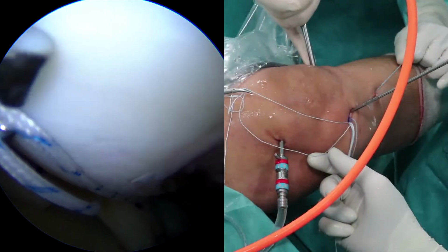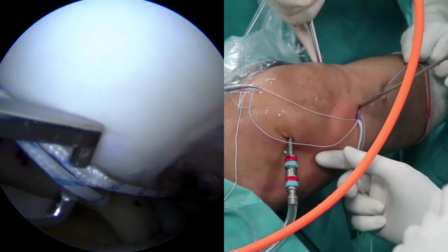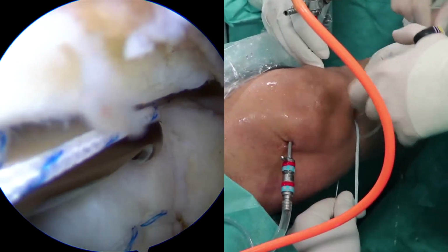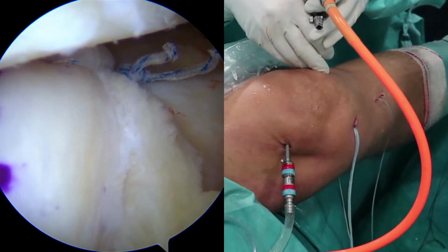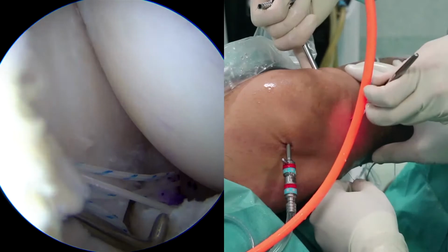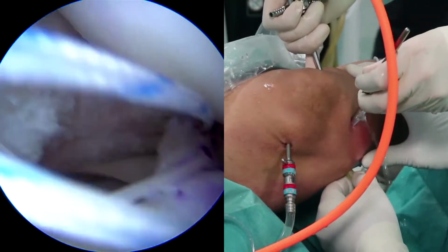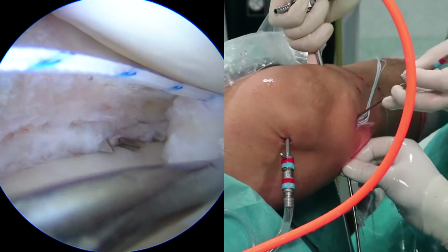Once the meniscus is set conveniently, the most posterior suture already passed through the posterior meniscal rim is extracted independently and tied down from the AM portal using a knot pusher and with alternating post half hitches until it is firmly secure. A suture retriever straight forceps is the tool selected to collect all the preloaded sutures of the meniscal body and anterior horn and then suture from posterior to anterior in order to attach the graft to the joint capsule.